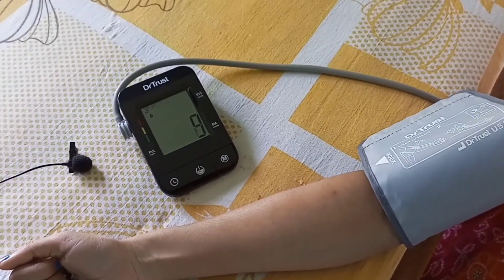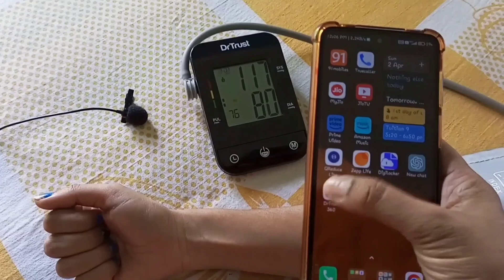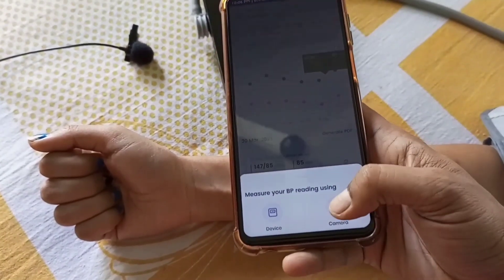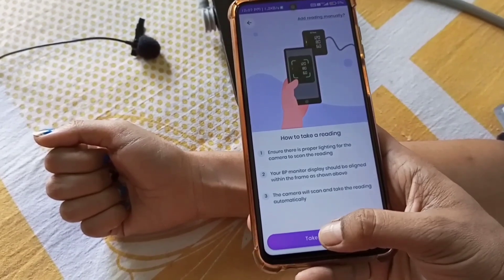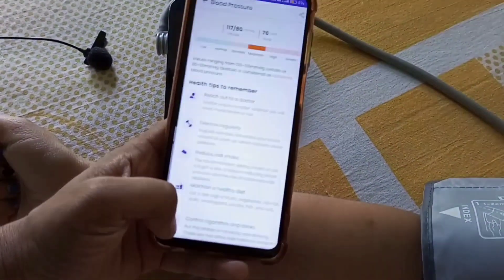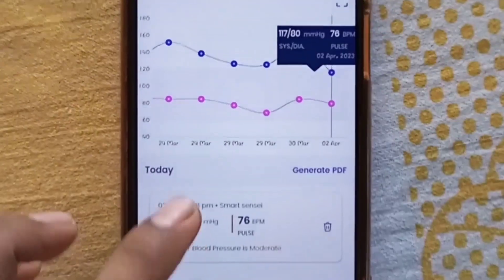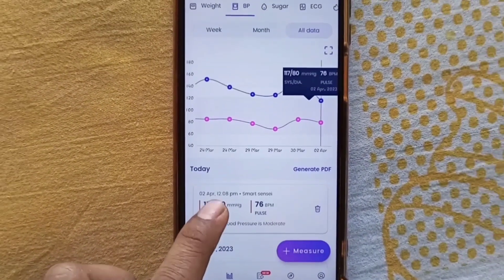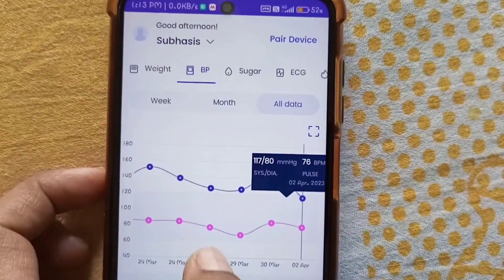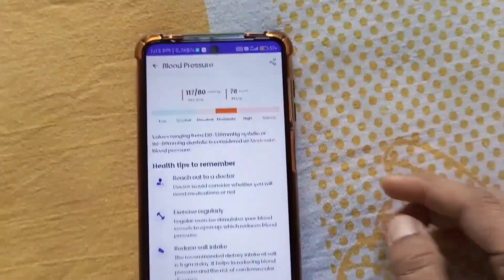I will show you how to record all the data obtained from this BP monitor using the Dr.Trust 360 app, which can be downloaded from the Google Play Store. Open the app camera, take a picture of the screen showing the reading — 117/80 and 76 pulse rate — and it will be automatically recorded. After storing several readings, the app generates a graph showing how your blood pressure is increasing or decreasing over time. You can tap on the last recorded reading to see the current condition — normal, elevated, moderate, or high. You can also view previous data and share the BP profile with your doctor by tapping the share button.